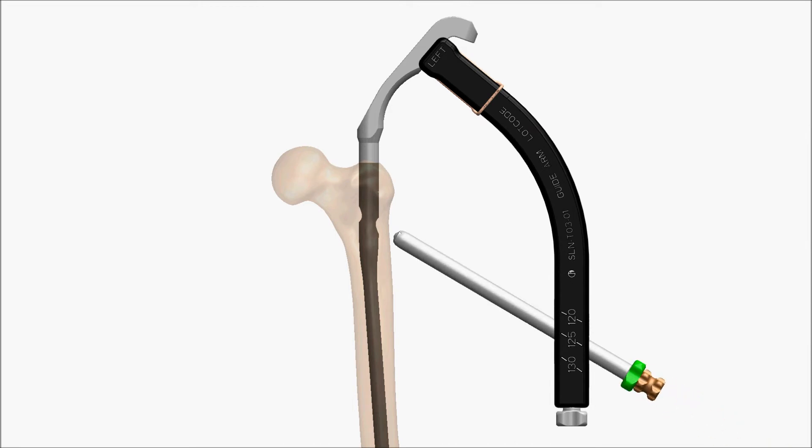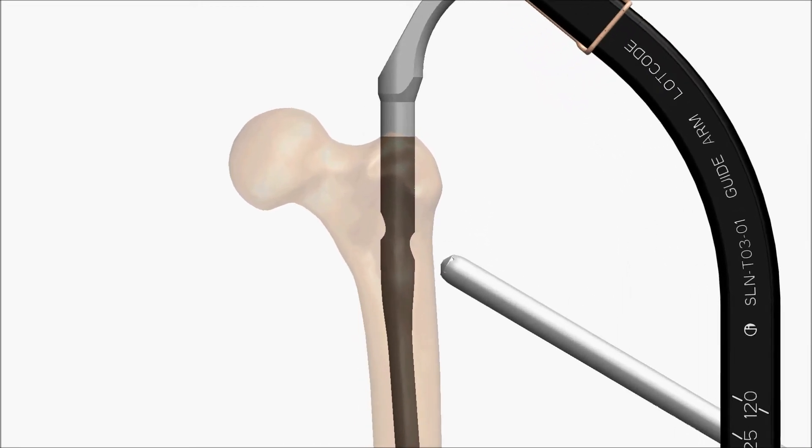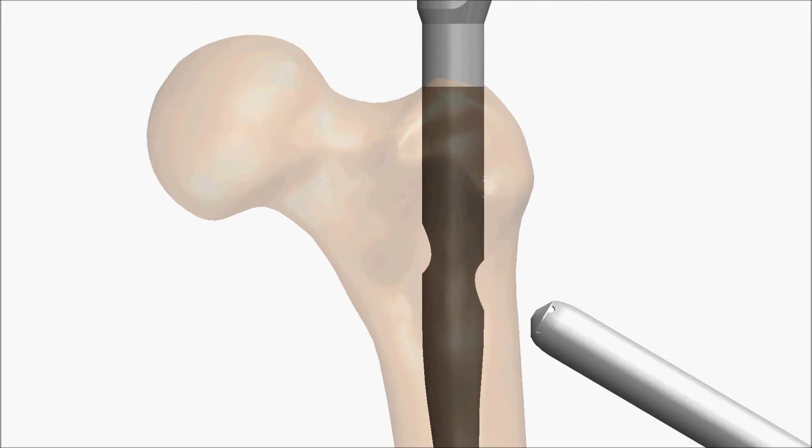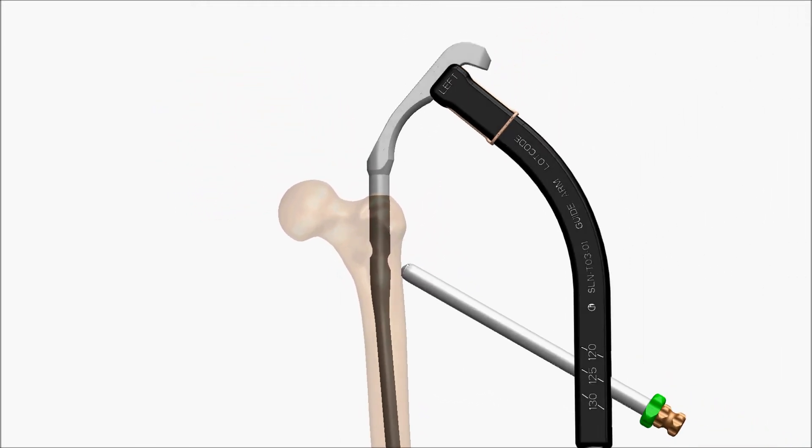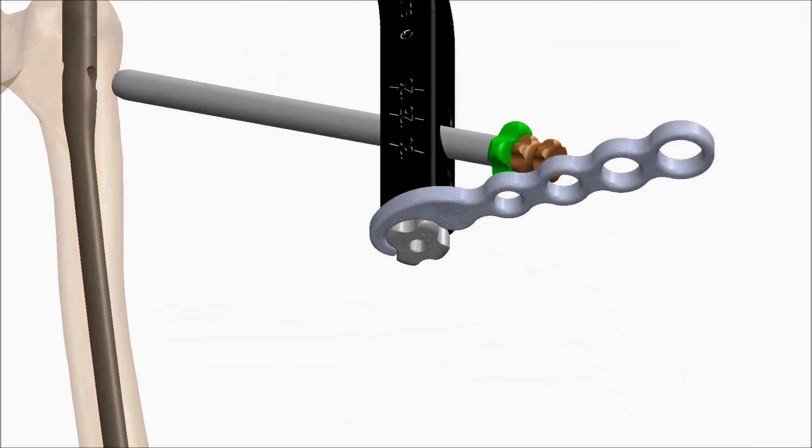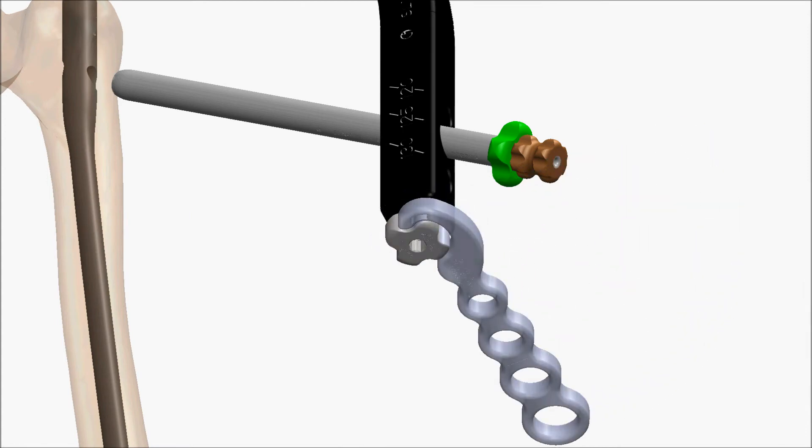Pass the guide sleeve and obturator through the guide arm and advance to the level of the bone. Ensure that the guide sleeve is in contact with the lateral cortex. Securely tighten the guide lock to ensure the guide sleeve remains fixed for the remainder of the procedure.